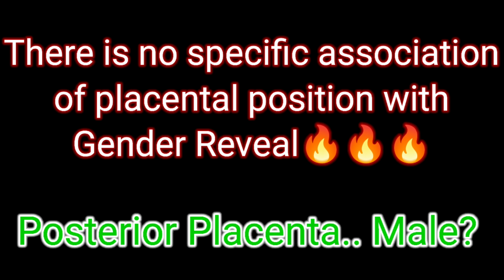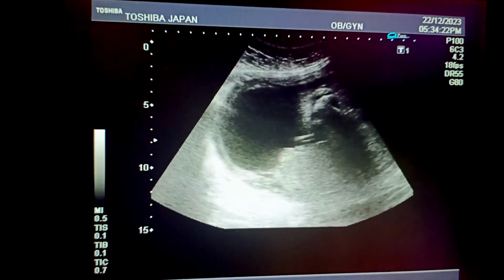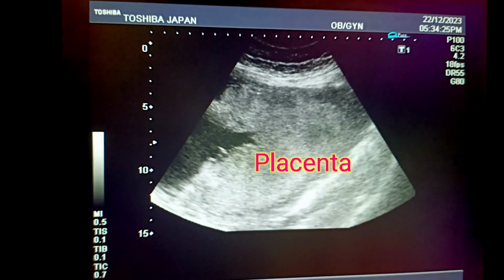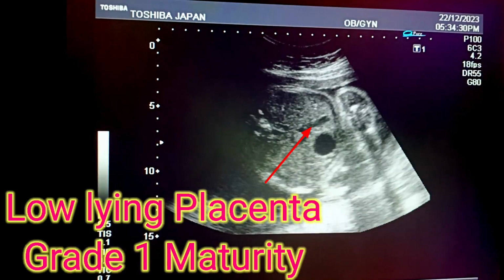There is no specific association of placental position with gender determination. Placenta could be posterior and there could be a male. Placenta could be anterior and there may be a female. I can show you in different videos a female with anterior placenta and a female baby, and posterior placenta and a female baby.